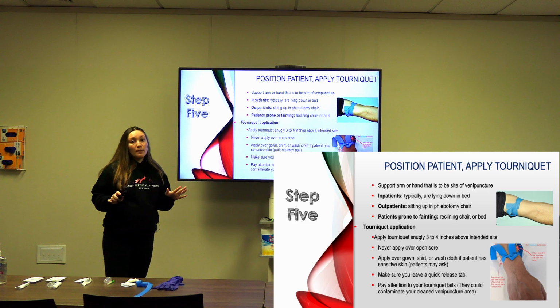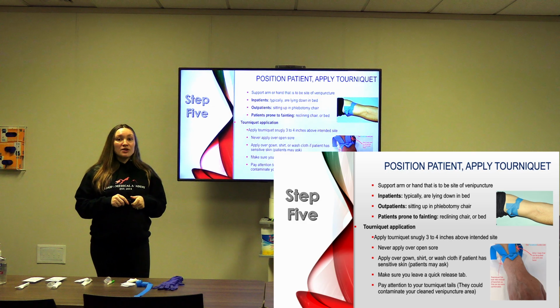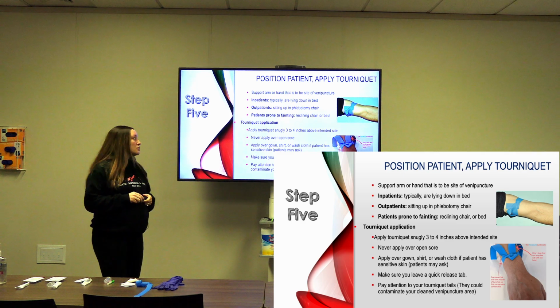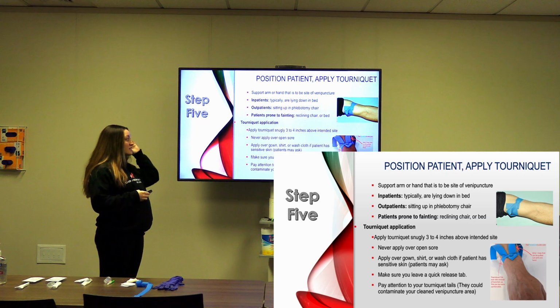Never apply over open sores. Look for these on older people, so geriatric patients. They have thin skin, they're more susceptible to open sores. And they'll also maybe ask you if you can apply it over their gown or use a washcloth, then you're welcome to do those things. Apply over a gown, shirt, or washcloth if patient has sensitive skin.